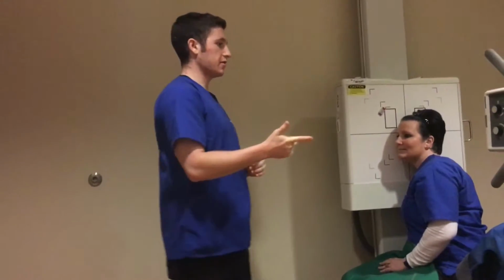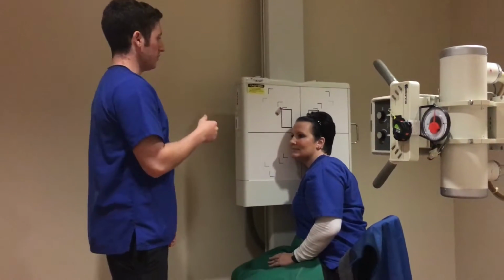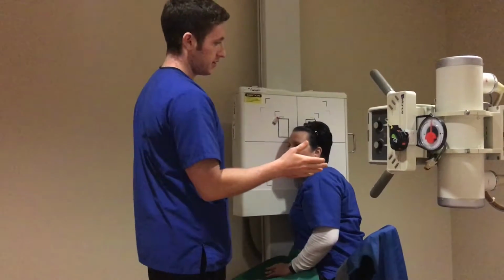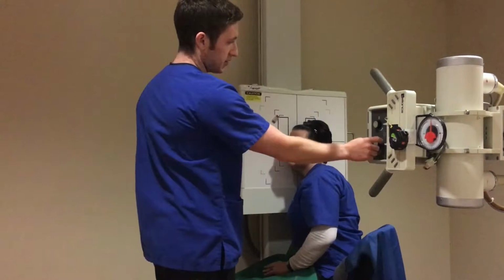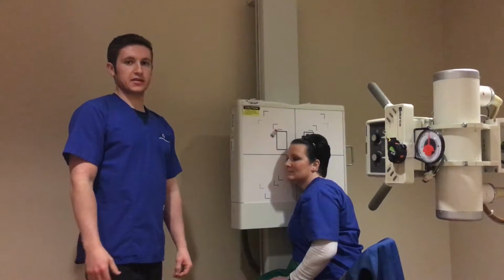I have my room set up here for the lateral skull projection. I have a 40-inch SID with a 10x12 crosswise cassette. I'm in transverse detent. I've collimated to a 10x12 here. Ready to position my patient now.